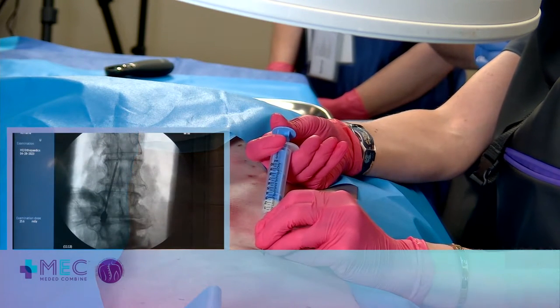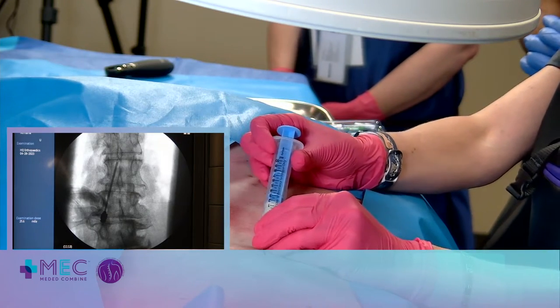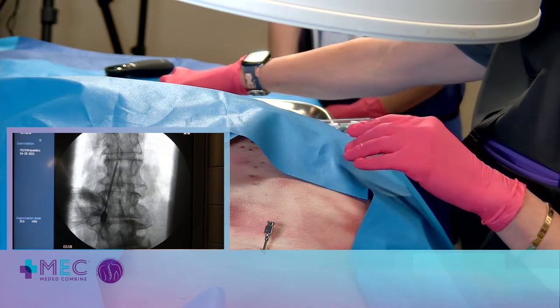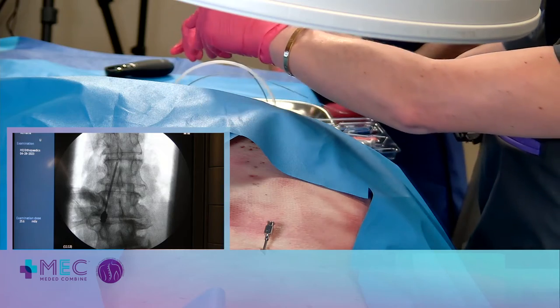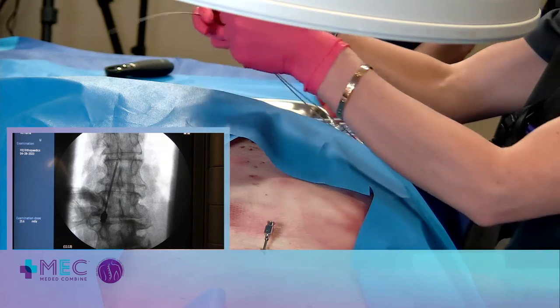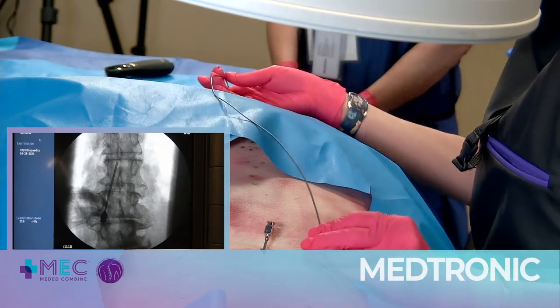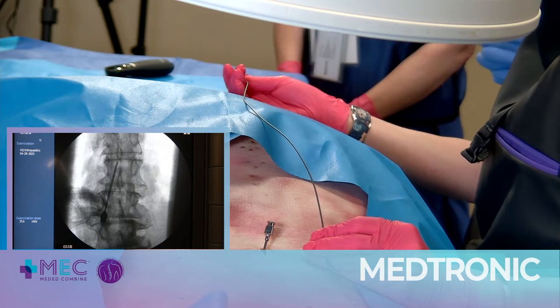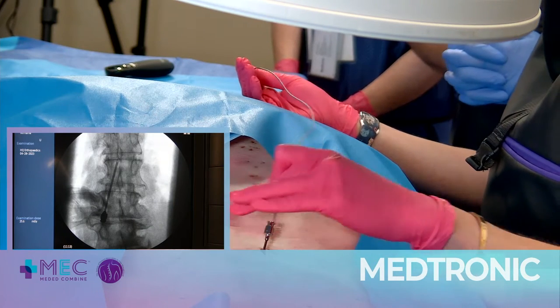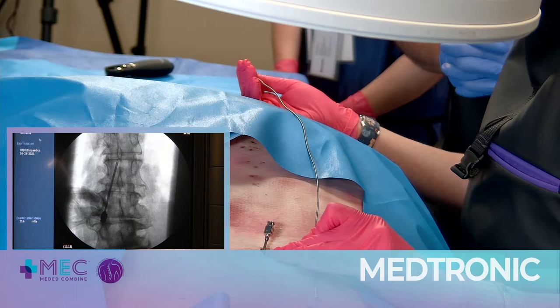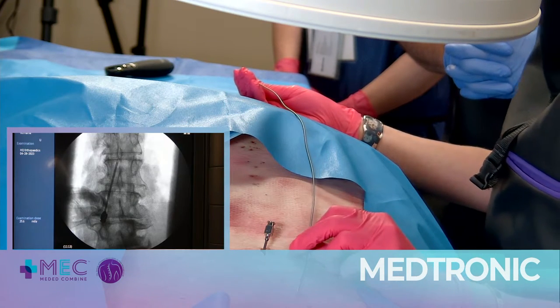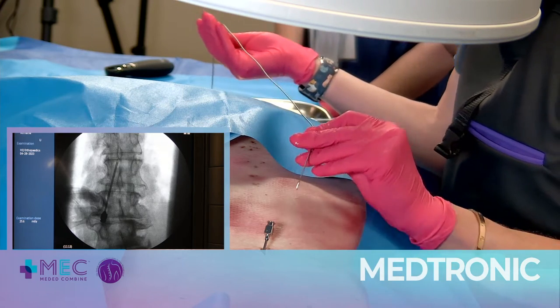That was a really good loss of resistance actually for a cadaver. One thing to point out is the angle of the needle. When we're doing epidurals we come straight down, but when sliding the lead in, you want to slide in the epidural space — you don't want to bounce off the dura. The way to do that is to have a nice angled trajectory. If you're doing both leads on the same side, which is what I normally do, I will hug the spinous process a little more to have space to put in that second lead.